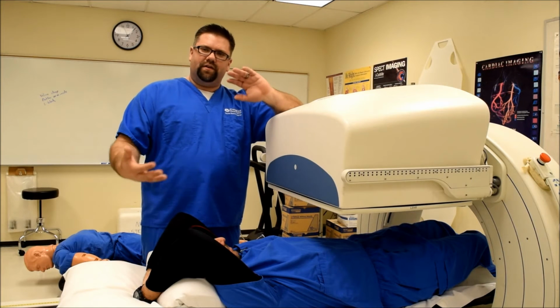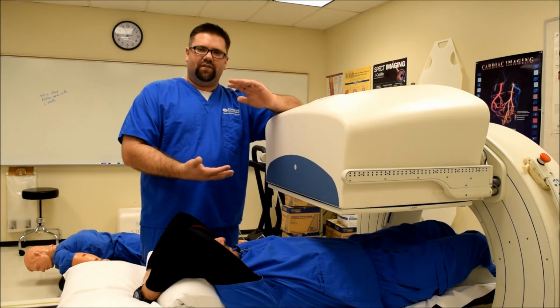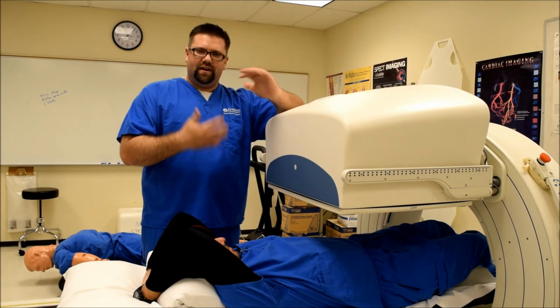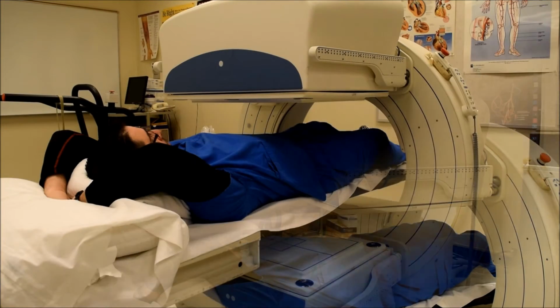Basically you're going to bring the camera heads in close enough to get good pictures, but you also want to make sure that they clear all the way around the patient. To do that, you bring them in and slowly move them around, making sure it clears all the way around.